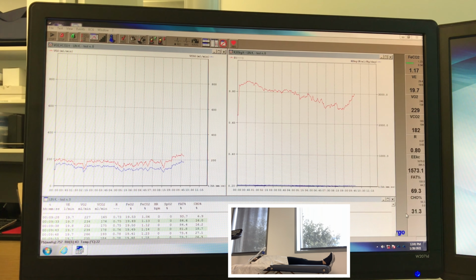So we're just reaching 10 minutes of data collection. I'm going to let it go for a few more seconds because it appears that the record of data is a little lagging behind the actual time of data collection. But now we've certainly collected enough, 10 minutes of data.